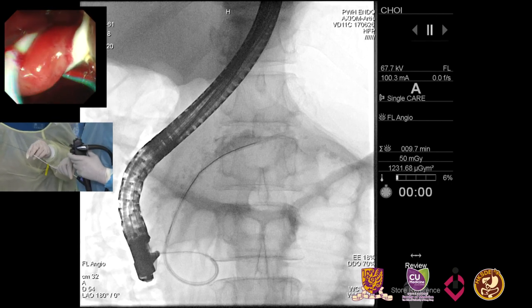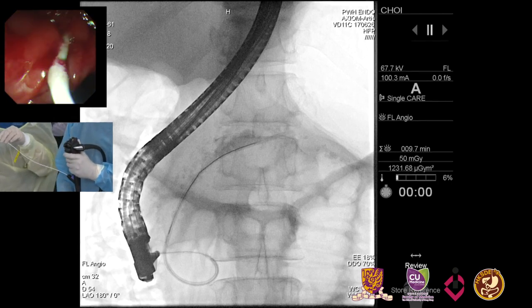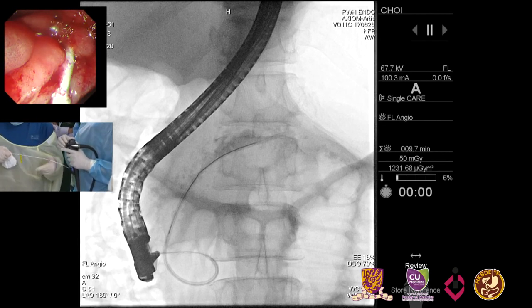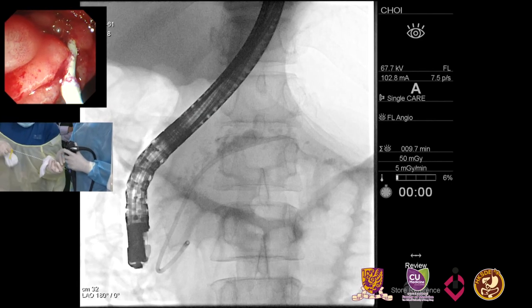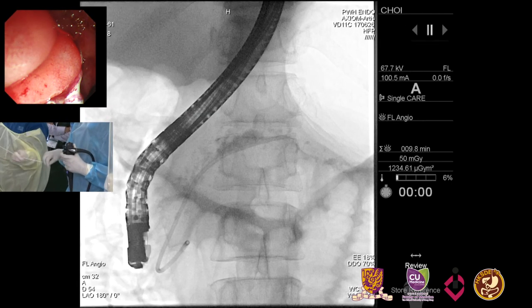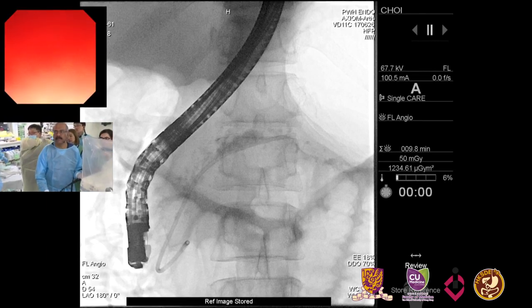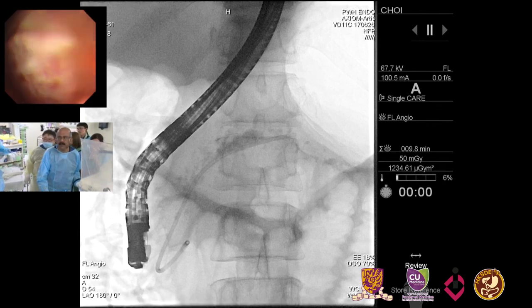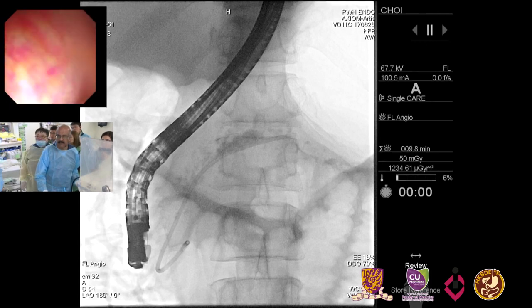We were discussing the stent length, and Nagi does the same as I do: if you're going to be repeatedly stenting the PD, each time we choose a slightly different length so that the end of the stent is not landing in the exact same spot repeatedly, which could cause some stricturing as well. I think that's a very important point. Change the length of the stent, and if you can, increase the size of the stent for the pancreas.